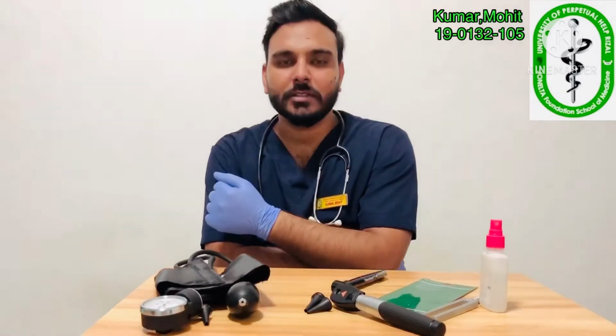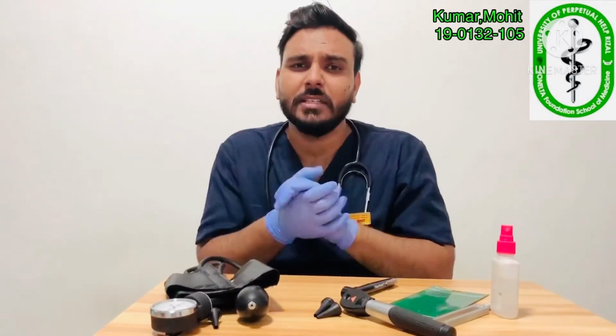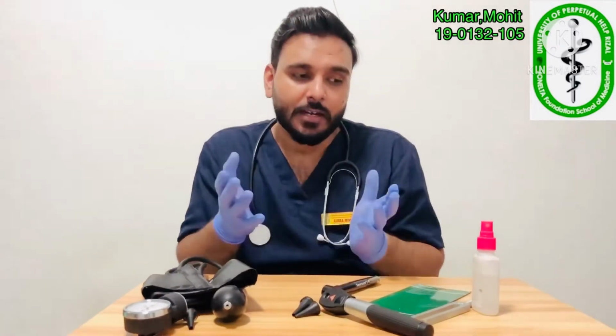Ophthalmoscopic examination was our last examination for the eye. We have covered all the fields, like the external examination and the vision of our eye with different tests, then the different types of extraocular muscle movements, and then we have seen the internal structure of our eye, like the optic disc and the retina and the sharpness of the optic disc edges. We have observed all these things, and the eyes were fine. That was a good point, and that was enough for the eye testing. This way we test our eyes.